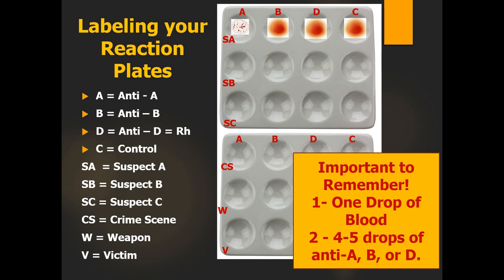So just 1 drop of blood across. Once you get this done, then I physically move with all my stuff to the next one. It might not go in order. I'm just going to look for who's open, who doesn't have a place. You can be on both sides of the desk.